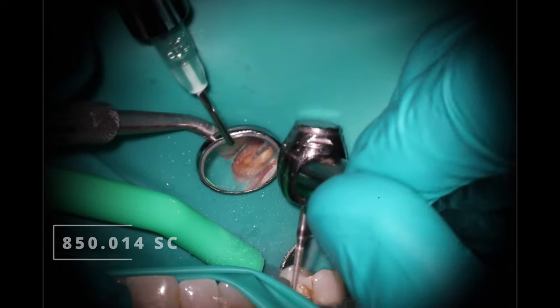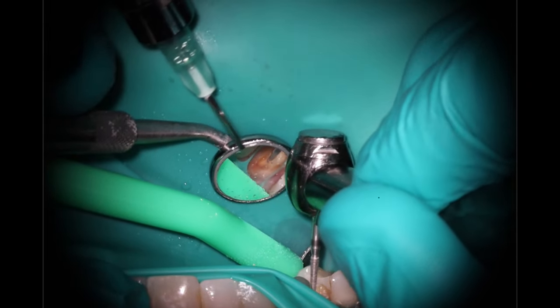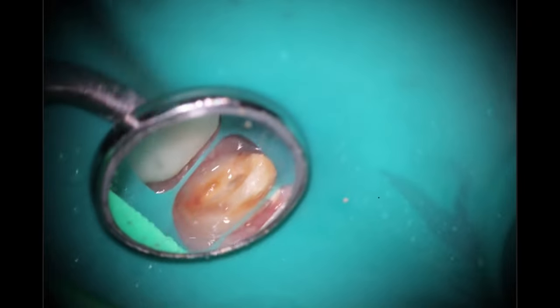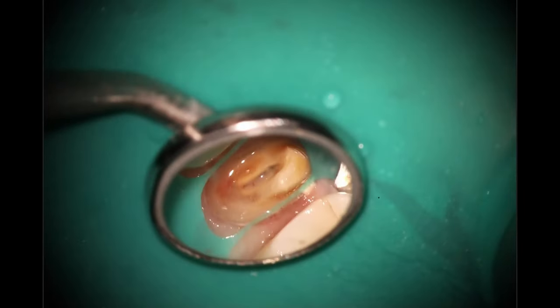Starting out here, just going back in to do the access. As you can see, we're right on top of where the canals are, so not very hard getting into this area. Just use that workhorse burr and expose the buccal there — need to go back and pick up the palatal just a little bit. Once you find one, I find it's easier on a multiple canal tooth to find one first, and then you know your depth gauge and everything else you'll need.